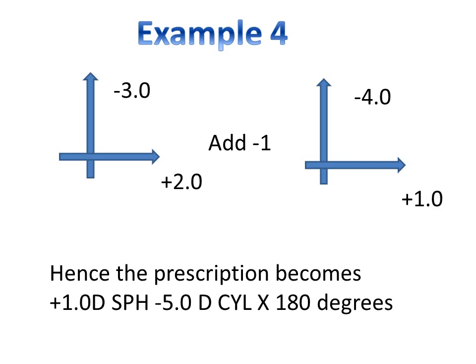When you write cylinder along 180 degrees, it will start acting along 90 degrees. That is the reason why you are giving a cylinder at right angles. Normally, whenever you are choosing the spherical component of the spectacle, numerically whichever is lesser is considered for selecting it for spherical component. The higher one is later selected for cylindrical component.